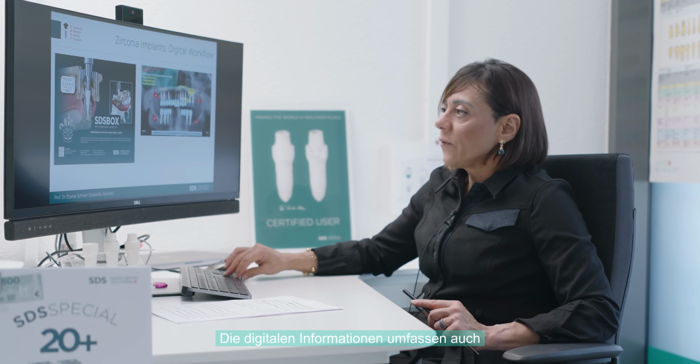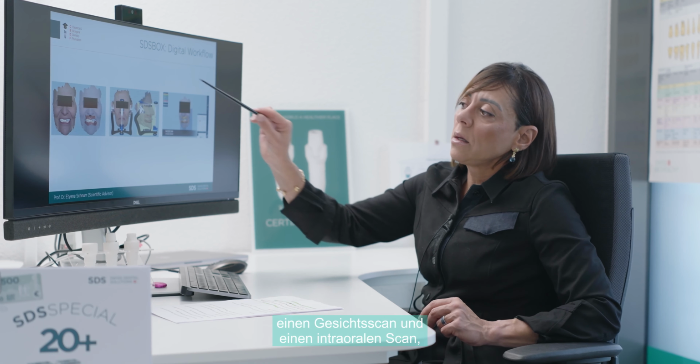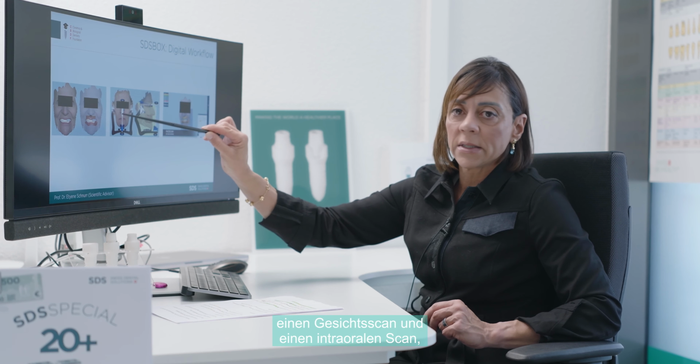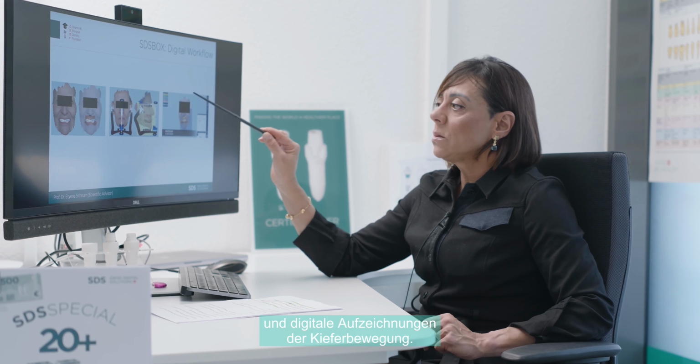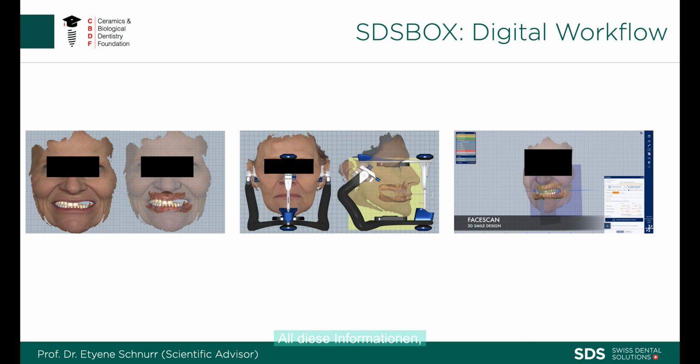The digital information also comprises a facial scan, an intraoral scan, and digital recordings of the jaw movement.